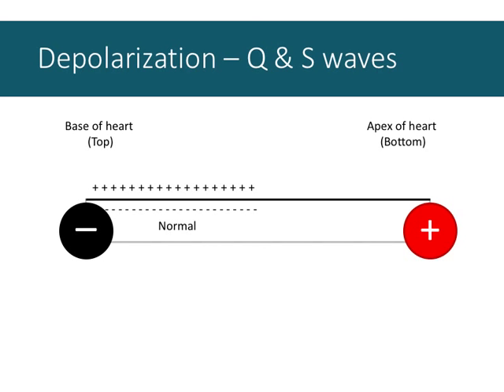But since our monitoring electrodes are fixed, the relationship of the wave to the monitoring electrodes is different, and so the signal is different. If we ever have part of the heart where the signal is transduced from the apex back towards the base, from the bottom of the heart back towards the top, or from the right of the screen back towards the left, I'm just saying the same thing, then the depolarization moves from right to left.